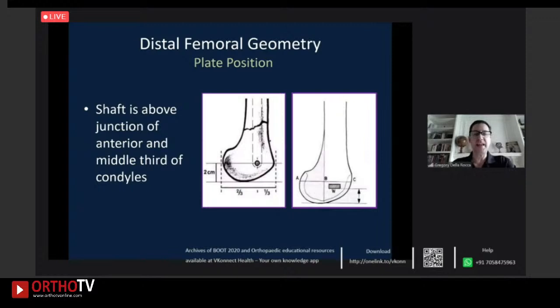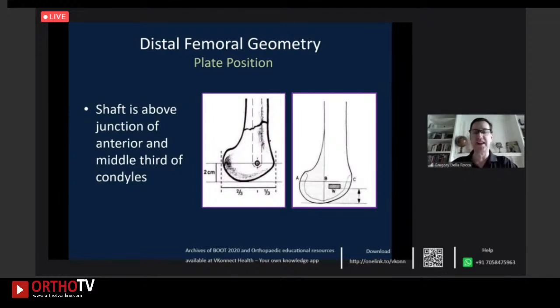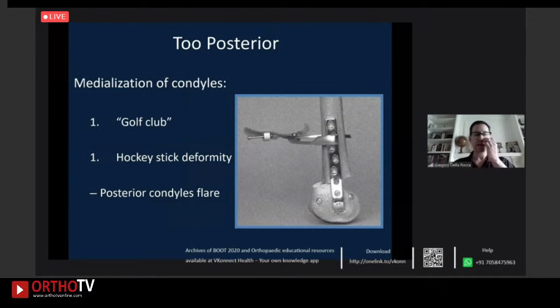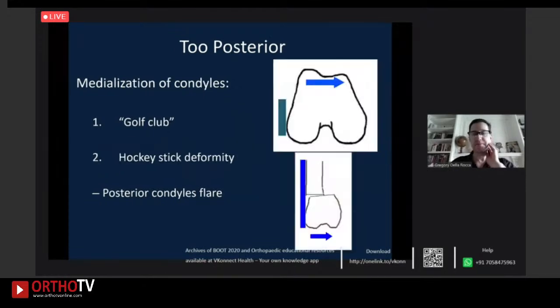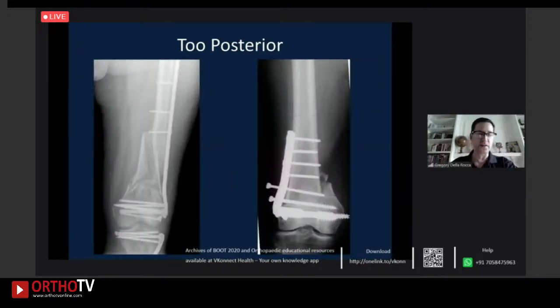The shaft sits above the junction of the anterior and middle third of the femoral condyles. If you want to align a plate with the rest of the femur, it needs to be positioned anteriorly. If placed too posteriorly, the distal femur won't align properly with the shaft, creating a golf club or hockey stick deformity — the plate drives the distal femur medially. Make sure your plate is not too posterior.